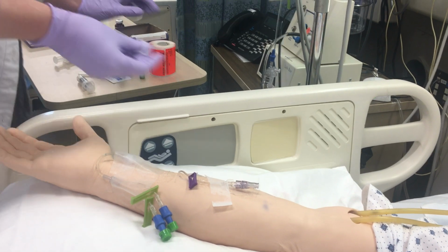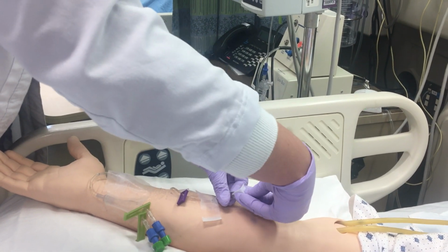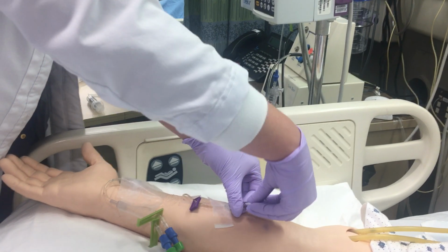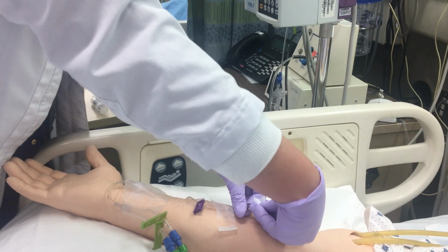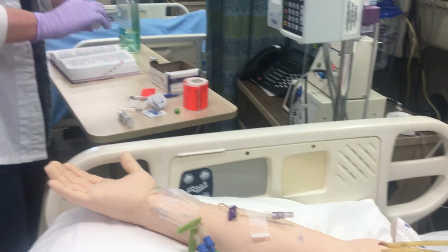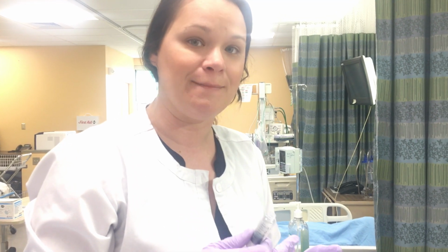I've disconnected that syringe and I'm cleaning for an additional 15 seconds. Now, the final saline flush is going to be administered at the same time or rate of administration as the medication. So, again, this would match the medication administration time. So the medication was over 1 minute. This will subsequently be over 1 minute.